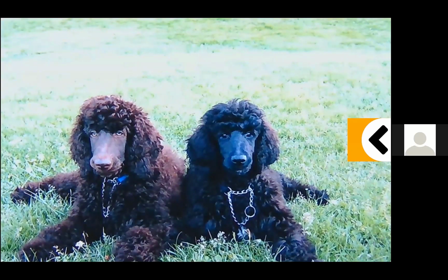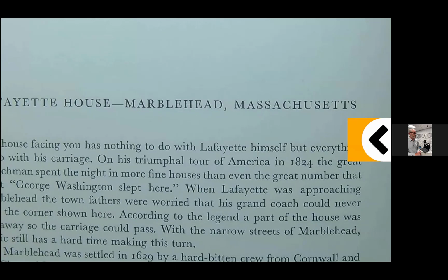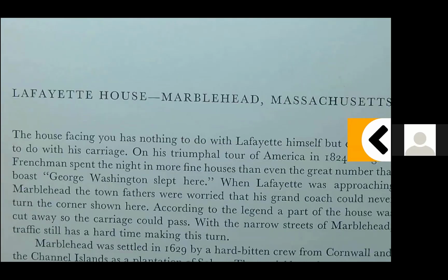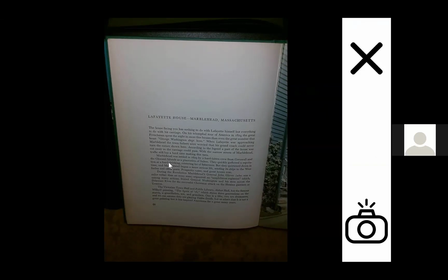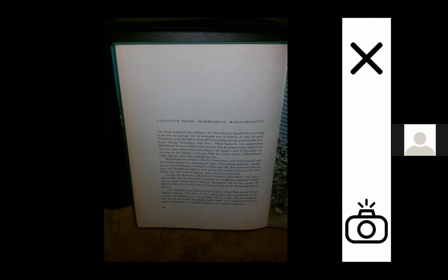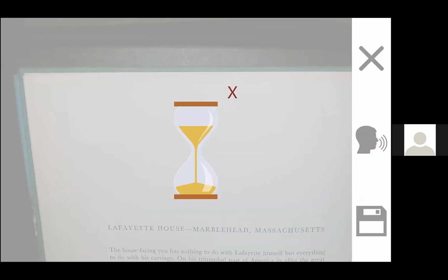If for some reason, so I'm going to swap that photo out and go back to text here for a second. And OCR document. And so you've got two options here. You can actually, on the right-hand side, you've got an OCR camera. And so that is the image of a page of paper with a little camera on the bottom right of it. So I'm going to click on that. And here is the entire page of this book. And down the bottom right-hand side, so at the top, you've got an X, which would close you out of this. Or on the bottom right, you've got the camera image. So if I click on that camera, I hear the snapshot again. I then will click on this icon of the man with the voice to do the scanning. You'll get a little hourglass that pops up on the screen.